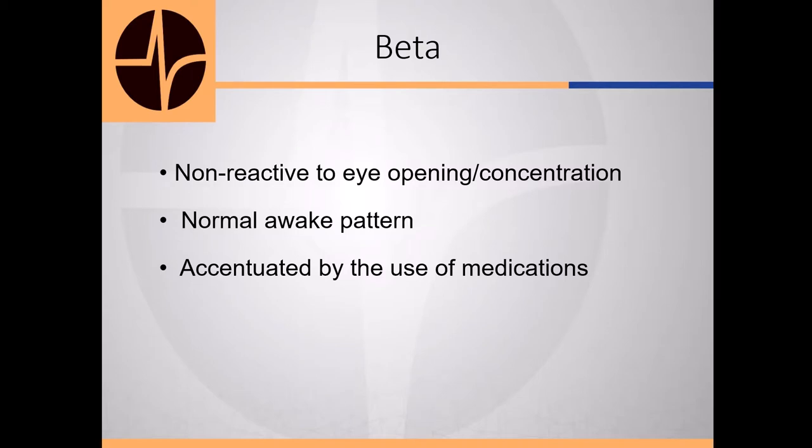And so generally, adults that have this pattern that is not being used, not on any barbiturates or benzodiazepines, things like that, their EEG is actually pretty low voltage even, and so we call it a low fast, and it's a normal variant, and you really can't see what their background activity is until they start to get a little drowsy.